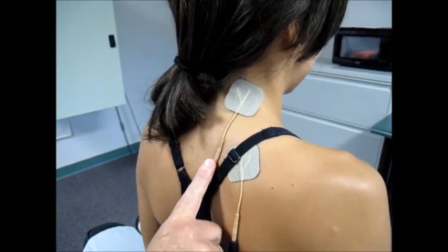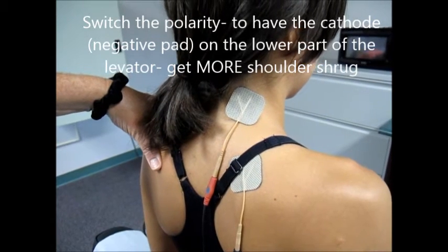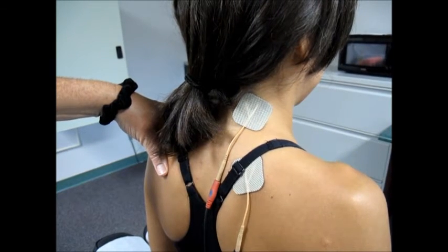Now what I'm going to do is keep this as the active — in quotations — and switch this one to positive. Same exact thing coming up. Would you say the shoulder shrug is bigger on that one? Look at that, and then come back down.